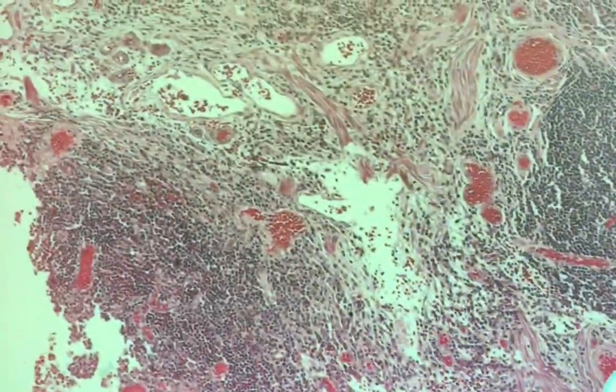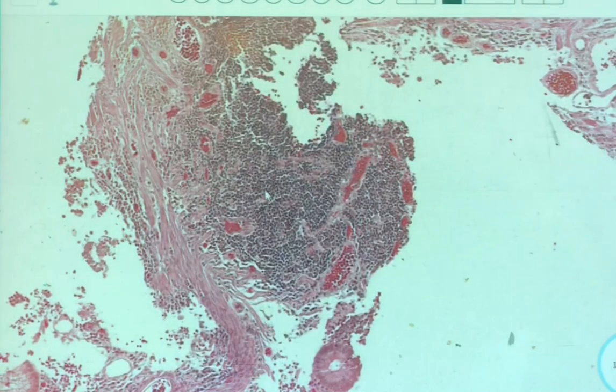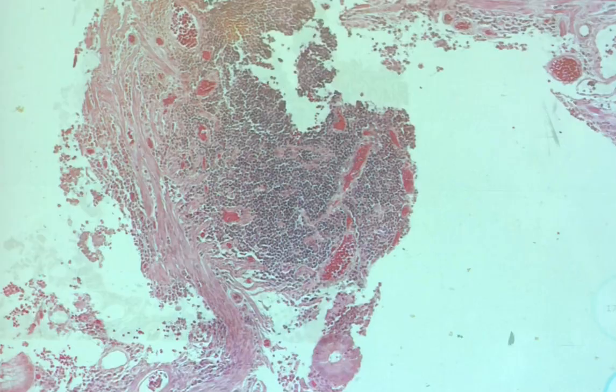Is vascular injury associated with this lesion? Kicked it out, no. Okay, so we have some crypt distortion. This is a normal vessel. Okay, this is a perforating vessel, so that's fine. That's not abnormal at all.